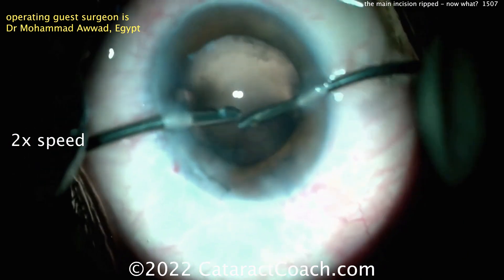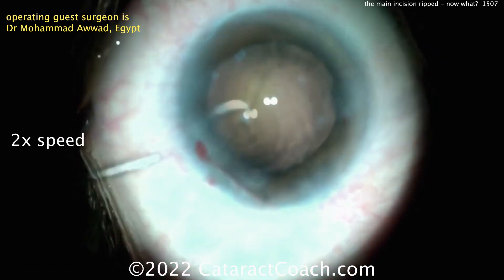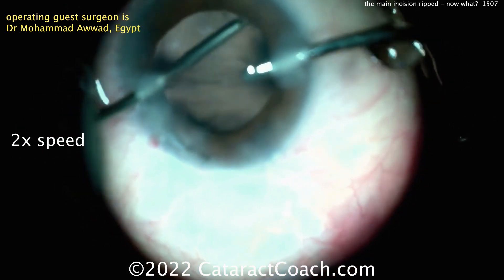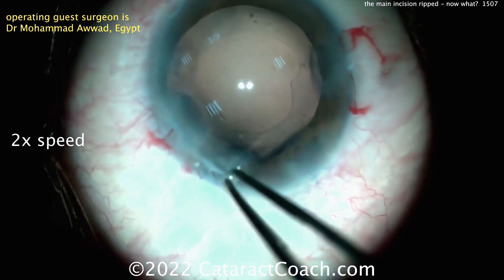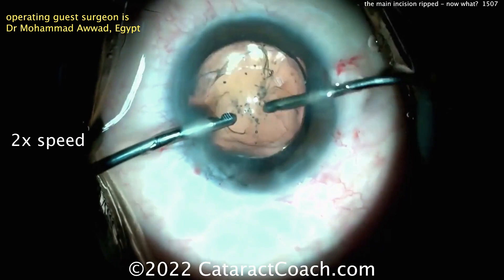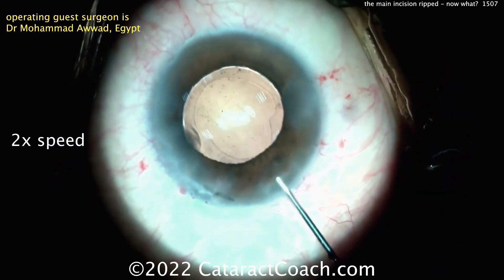Move the scope over if your temporal sits superior, et cetera. Now cleaning up — all looks pretty good. A little bit of cortex remaining; that can be removed pretty easily. A little bit of irrigation-aspiration here on the bimanual technique. You're watching that incision to make sure it doesn't leak. If it leaks, the problem is you upset fluidic balance. Remember, there's only one source of fluid inflow into the eye, and that is the BSS bottle or BSS bag. There are two sources of fluid outflow typically: one is leakage through your incisions, and two is what you aspirate on the FACO probe. Here we have a third spot, which is the abandoned incision also leaking. So you have to keep in mind the fluidic balance of the eye.